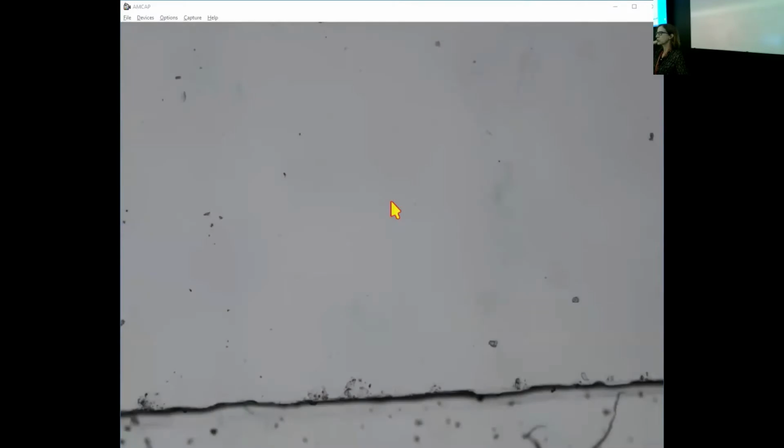We have seen several cases which are massive, really massive. Is that something? Yeah, so that's a good question. The question was about this type of pattern of invasion of rounded nests that can look like DCIS, and frankly, maybe some of that was.